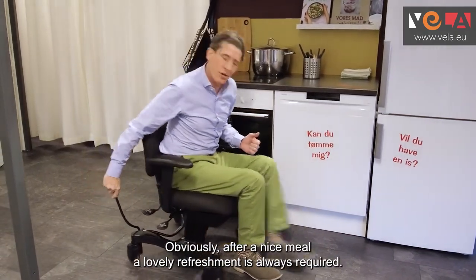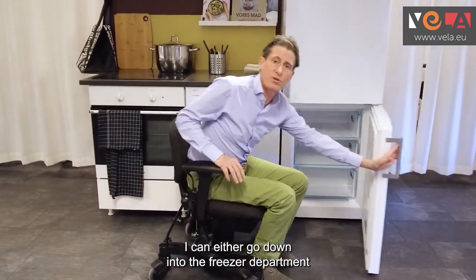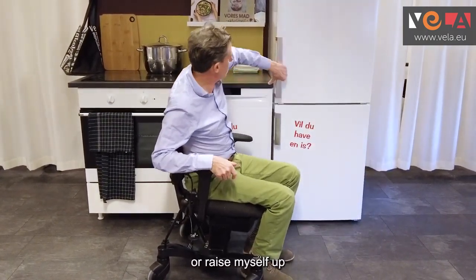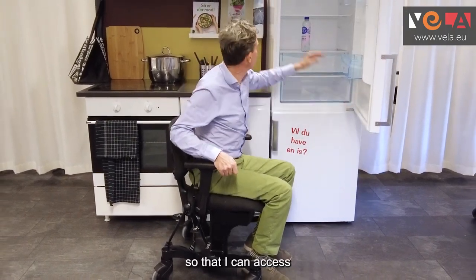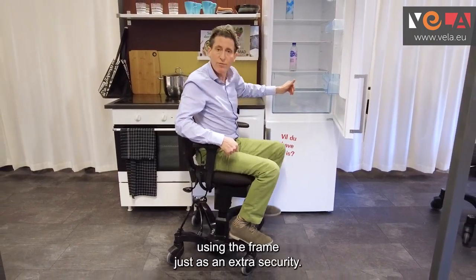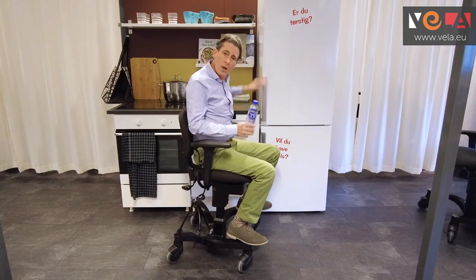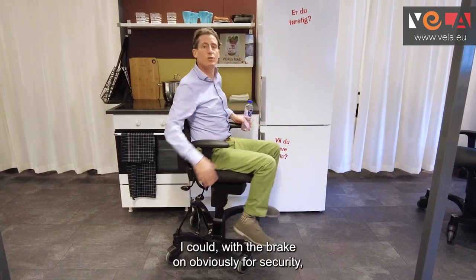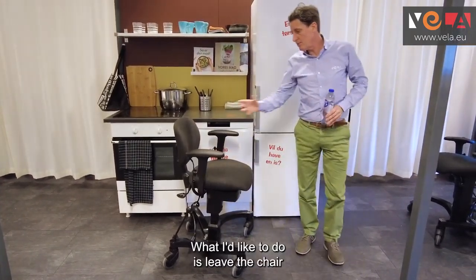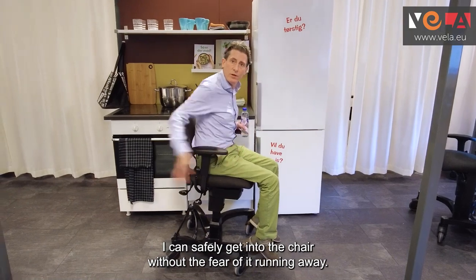After a nice meal a lovely refreshment is always required, so again I apply the brake. I can either go down into the freezer department at the lower levels without falling, or raise myself up to access any refreshments, using the frame just as extra security. With my water in hand, brake on for security, I can exit the chair safely. I like to leave the chair with the brake on so that when I come back I can safely get back in without the fear of it running away.